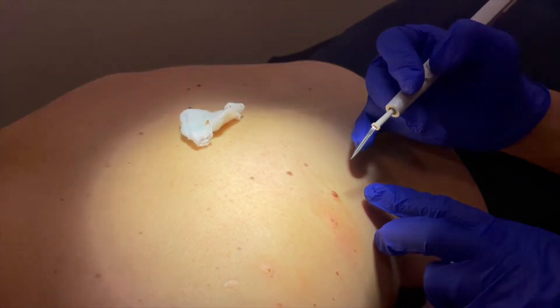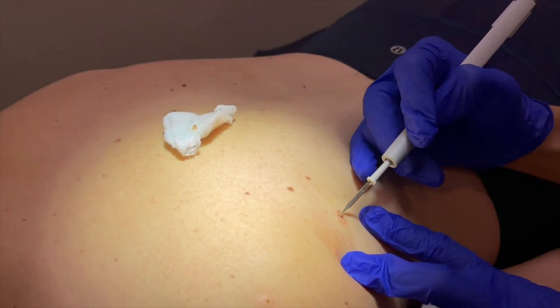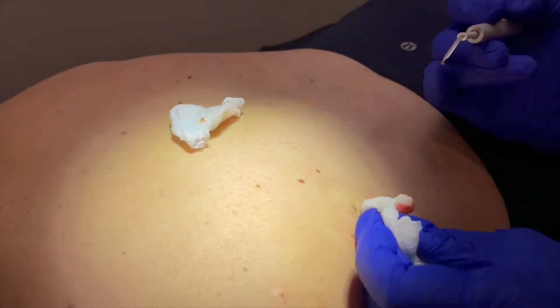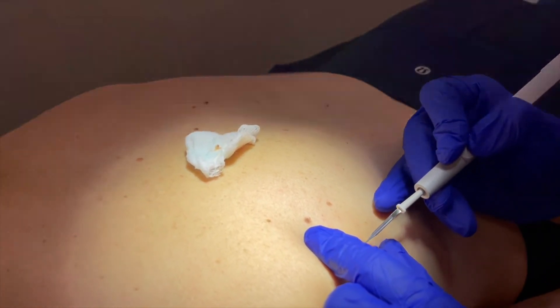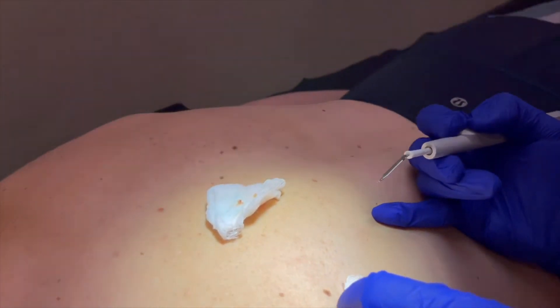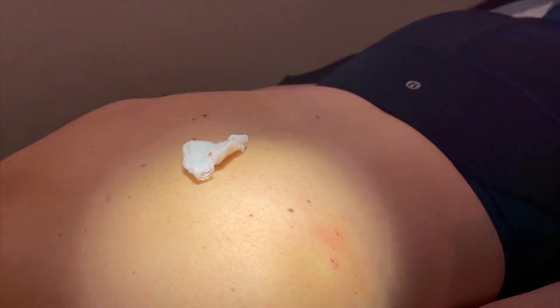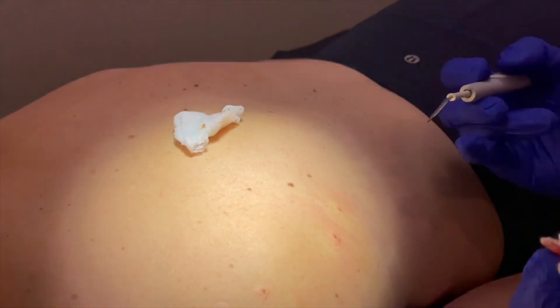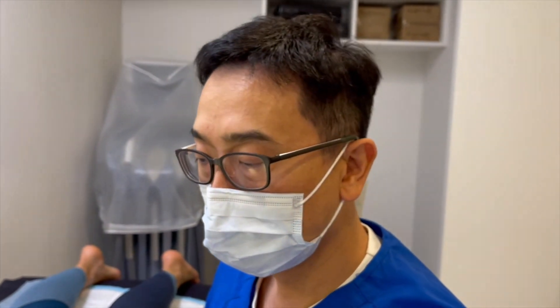For seborrheic warts or seborrheic keratosis, which are aging warts, we simply vaporize it, wipe, and it comes off — maybe just a little bit more. Then we put a little bit of antibiotic ointment and a simple band-aid dressing, and that's it.